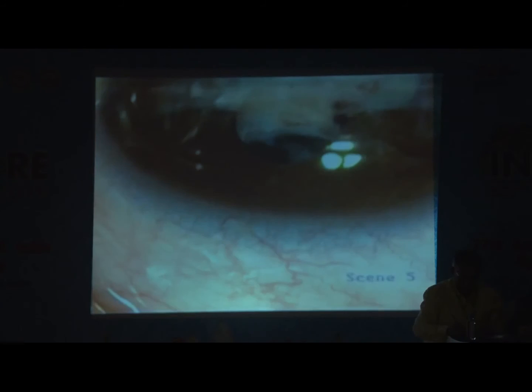The more the iris handling, the more the inflammation. A stitch in time saves 9. It is better to stitch than leave a micro leak, because it's a pediatric cataract and will be under anesthesia.